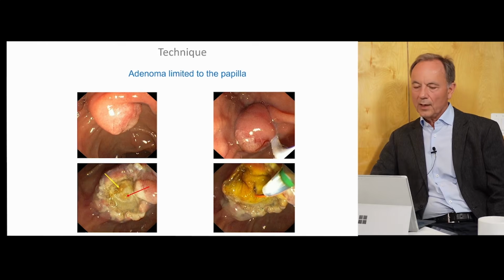And I don't perform ERCP before papillectomy. It's another very important message, because there are recommendations to inject blue and this and that to find the pancreatic duct, but you don't do that. Yeah, okay, this can be considered from this point of view.